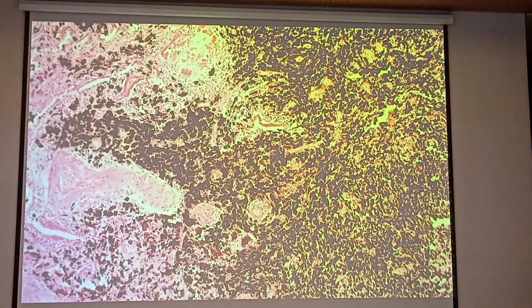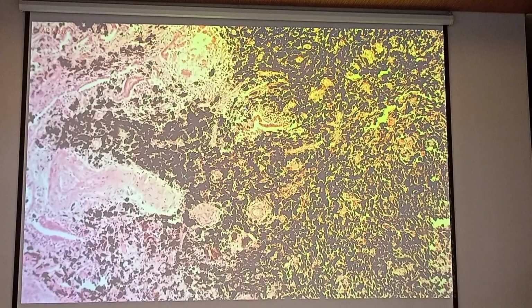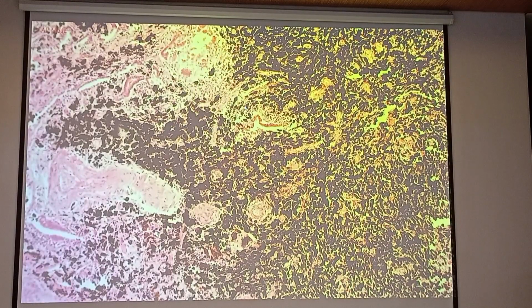The one in the book, actually, is silicosis. 143. Am I right? In our manual, what I mean by book is the manual. The title of this slide is silicosis. But one cannot see the silicon particles. What you can see here is actually the one that comes along with the silicon mining, which is carbon.